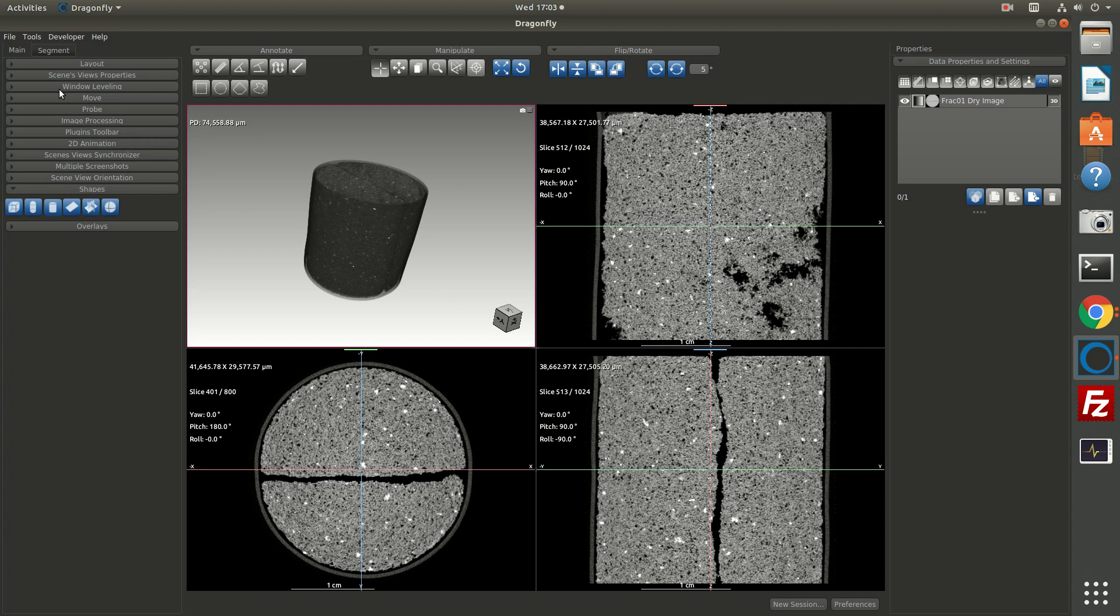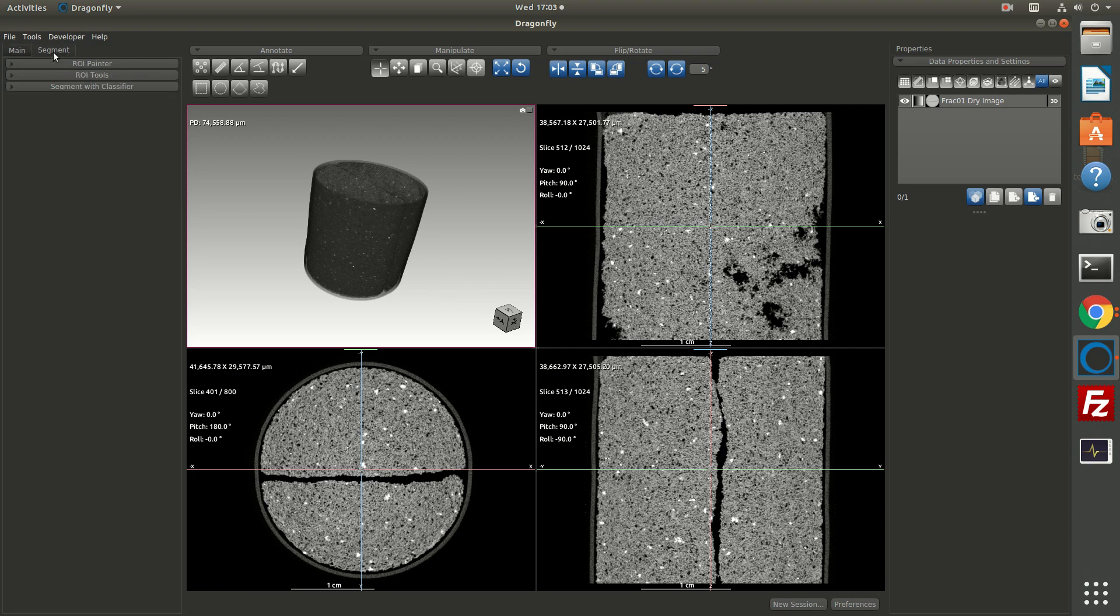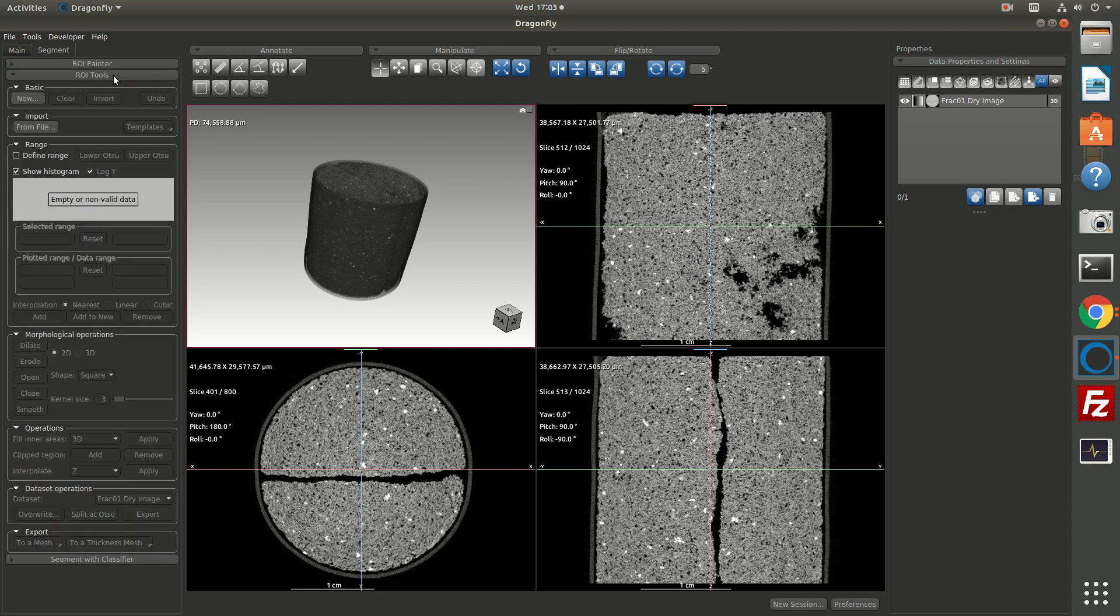We're going to start by going to the segment tab. The segment tab has three panels: the ROI painter, the ROI tools, and the segment with classifier. ROI tools is where you can create regions of interest, which are the tools you use for labeling pixels.